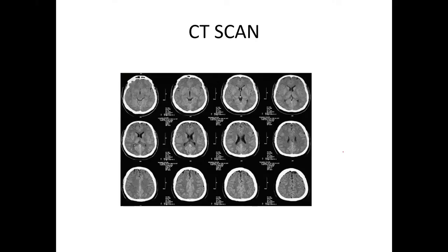Now we are going to talk about CT scan, brain CT scan. Now you should know the brain CT scan is a modality for evaluating brain pathologies, usually for brain tumors, brain abscesses, intracranial collections from bleeding following trauma, okay, intracranial hemorrhage, and other lesions.